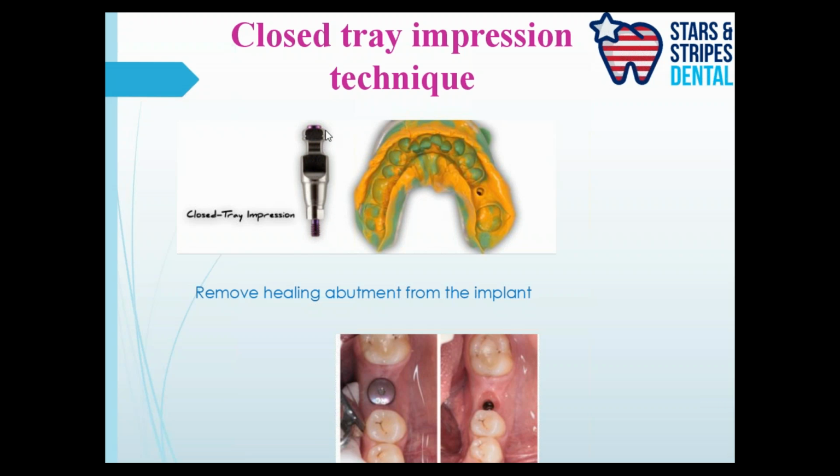That this component right here goes inside the implant. And there's something called the impression or the implant analog, which is actually given to the lab person. So these are the two most important things that you have to keep in mind as far as the parts are concerned. One is the impression coping or the impression post. The other one is the implant analog. Now, as we move ahead, I'll tell you the difference between these two parts.